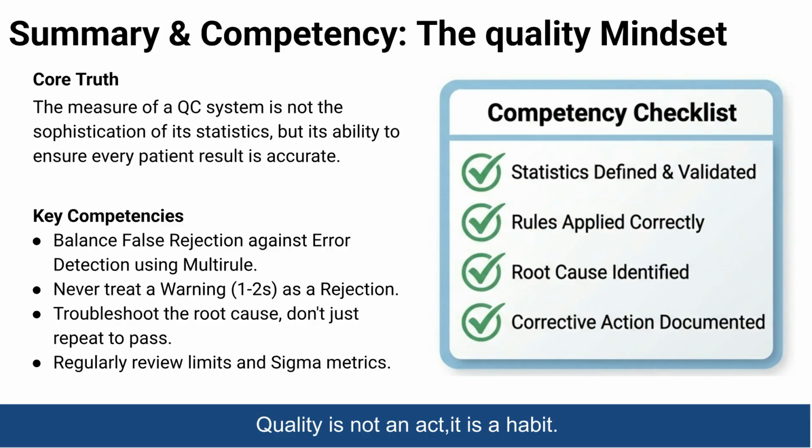Key competencies include balancing false rejection and error detection, never treating a 1-2s warning as a rejection, and troubleshooting the root cause. Quality is a habit.